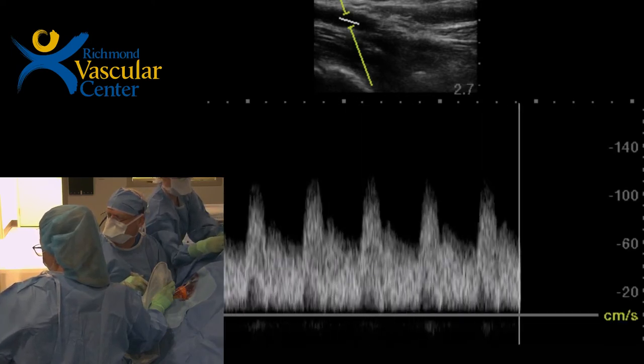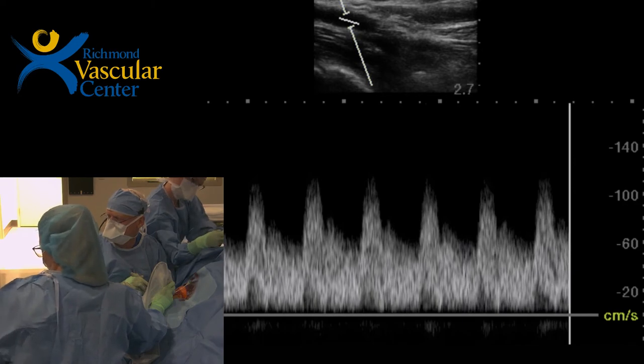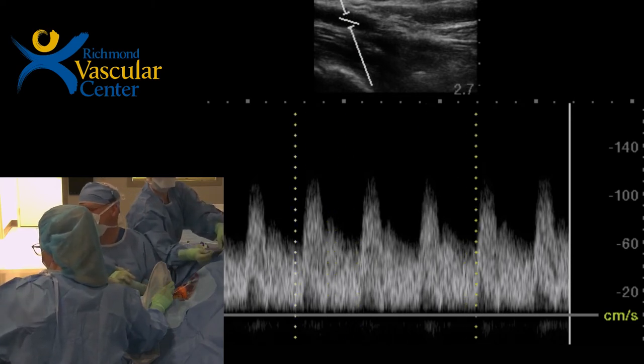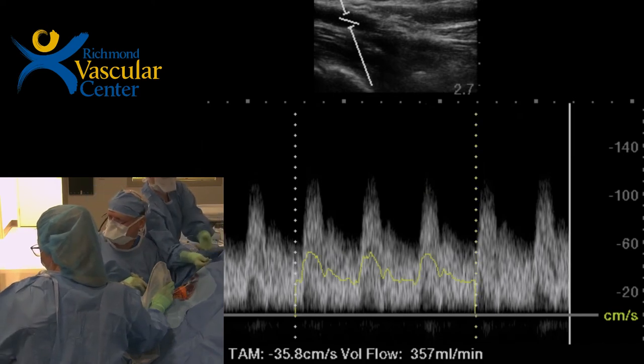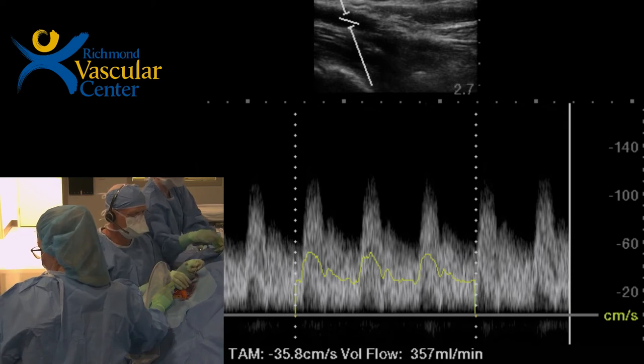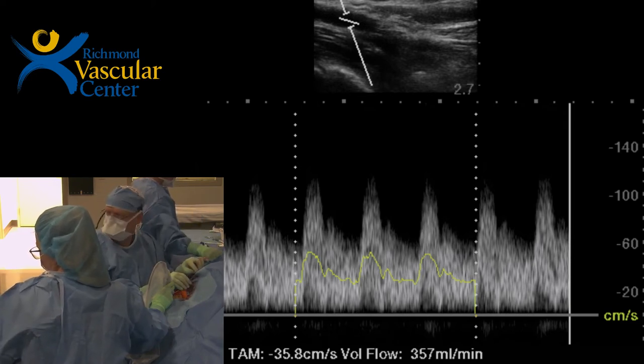So here's the waveform. Looks pretty good. Got pretty good diastolic component already, peak diastolic of over 60, smaller artery. So we always have to try and guess what this is going to be. How big was the artery? 4.2, so it's going to be 400. Okay, 357. Okay. Now we're going to balloon it.